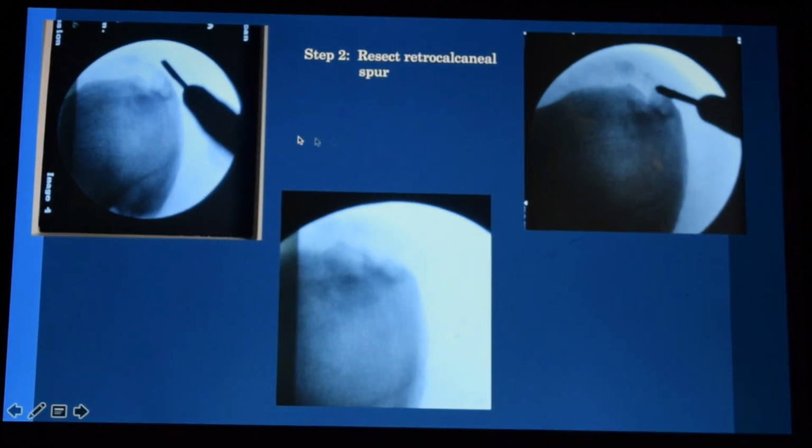And then once you have your retrocalcaneal spurring, your Haglund's, off, you'll go and do a superficial incision and, keeping the tendon intact here, begin to remove, stepwise, slowly, a little bit at a time, the actual spurring. So this is where the shoe is going to hit, and you won't have any pain after that. So we're going to show you a couple videos here of a patient post-op 1 week and also a month later, and how that works. We got 2 videos to show you.